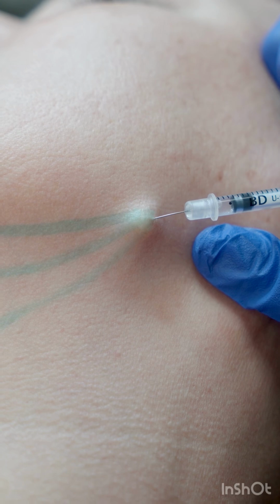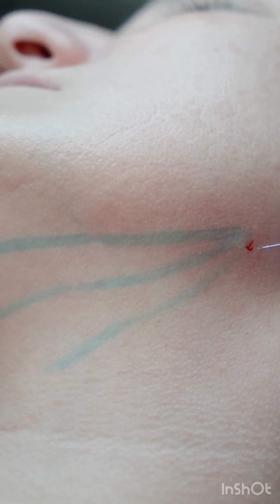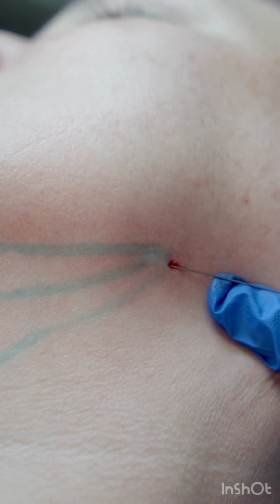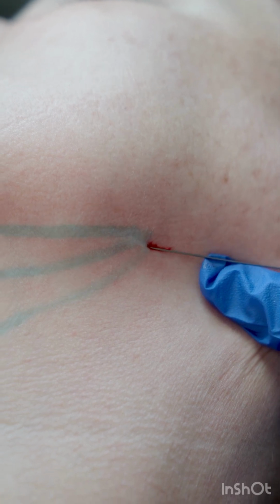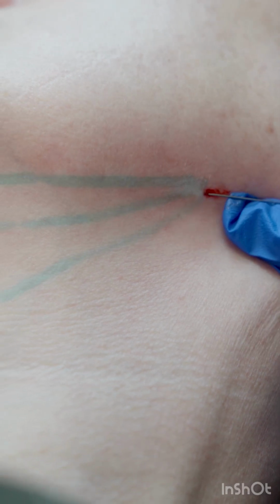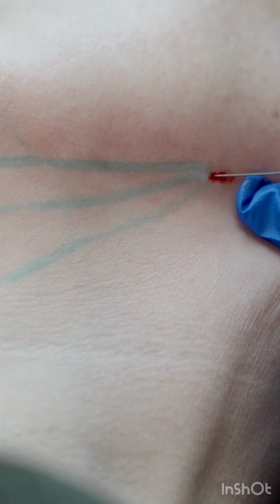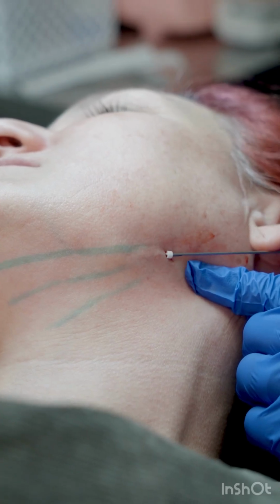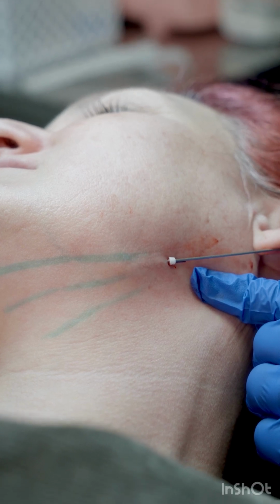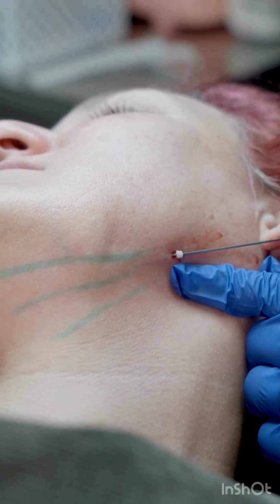Next, we are repeating the same steps on the other side by first numbing the area where the threads will be inserted, then applying additional lidocaine for numbing along the tracks that were previously demarcated to ensure that the procedure remains comfortable at all times. Once this is completed, then we start inserting our PDO threads to help achieve our maximum lift. Please continue to watch as the threads are inserted.